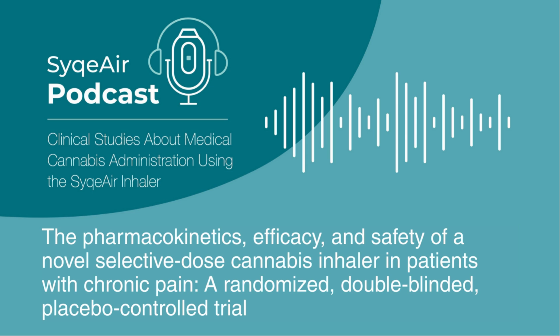That potential for effective relief with much lower metered doses also seems to line up with some other research mentioned in the paper, right? Like the Wilsey and Wallace trials. Yes, those studies also suggested that even relatively low doses of inhaled or vaporized cannabis could be effective, particularly for neuropathic pain. But the key innovation here seems to be the delivery system, the inhaler itself, its ability to provide those low doses so uniformly and consistently. Absolutely. That predictability is what makes finding an individual's optimal dose feasible. It allows for proper titration, like you do with conventional pharmaceuticals. It really moves medical cannabis treatment much closer to accepted medical standards.